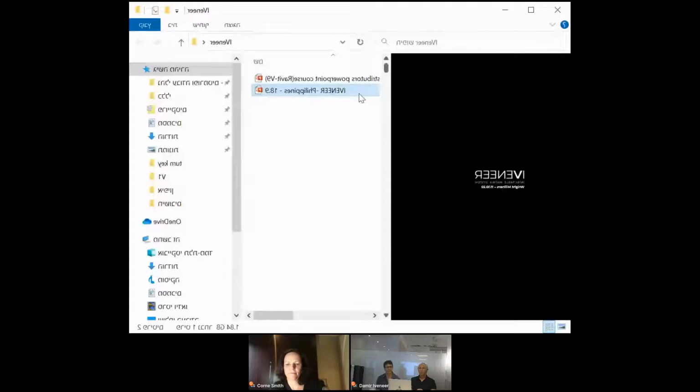Okay, so let's start the lecture. This lecture is about iVeneer, injectable matrix system. And we use mostly flowable composites, so we restore with flowables.